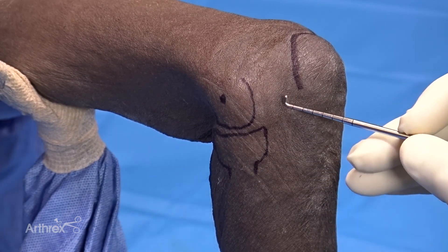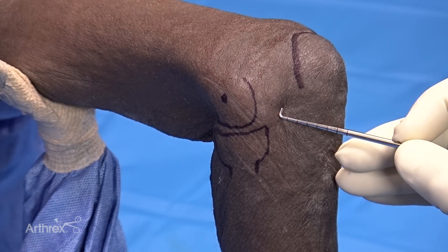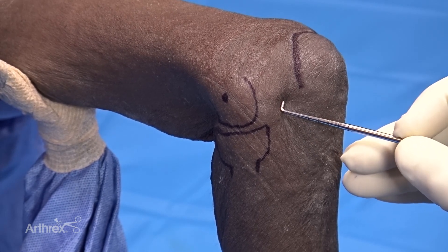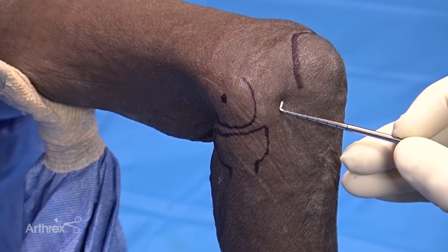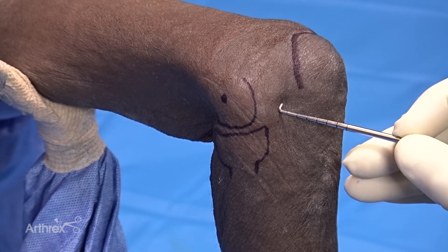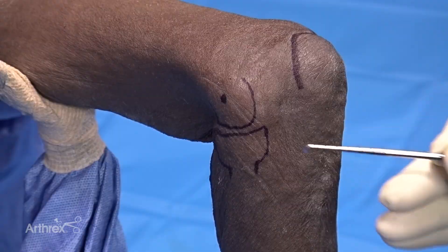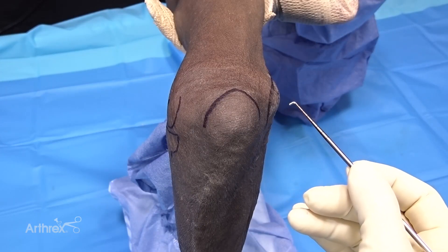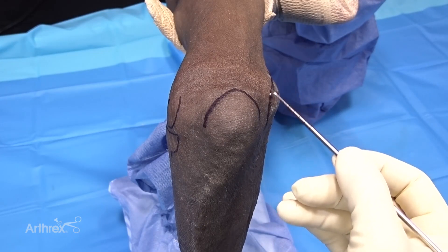The soft spot location — typically used for injections or arthroscopy — would be here, and then the medial epicondyle and ulnar nerve.